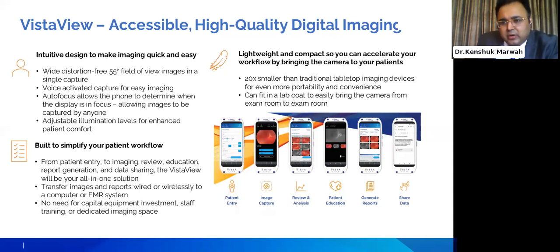Some people who are doing corporate testing, and in villages, in camps, if they have a tertiary center, through your trained staff you can get the images to your retina specialist to see. I think this is where the world is heading, that our workforce is not growing in that regard, but at least with technology like this, the images can be transferred to a tertiary care center, and the diagnosis can be done. So things are very easy.